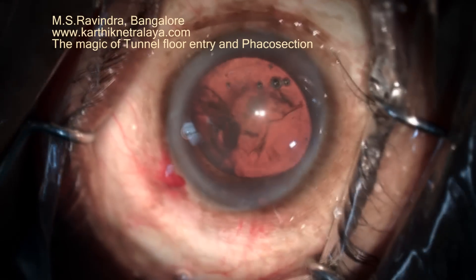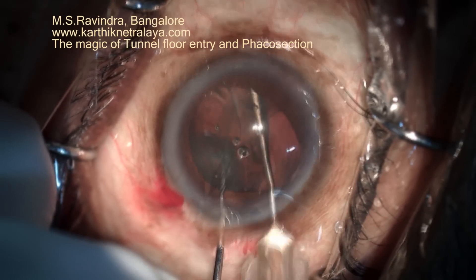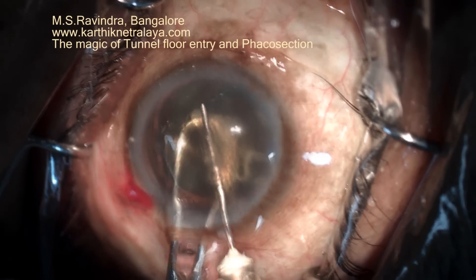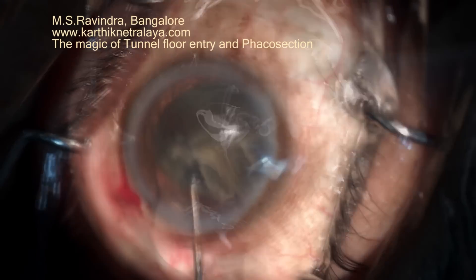Hydro-dissection is performed. Rotate the nucleus with the epinucleus and bring it to the anterior chamber, then bisect or trisect it depending upon the size of the nucleus.